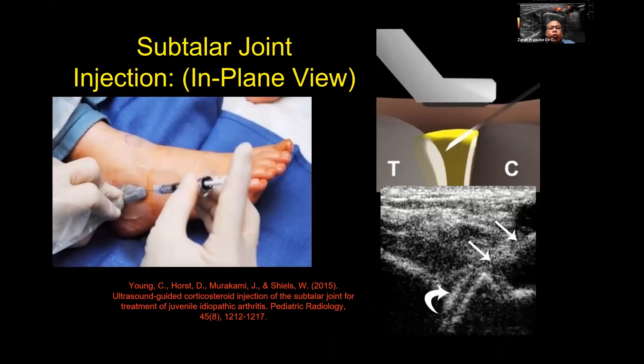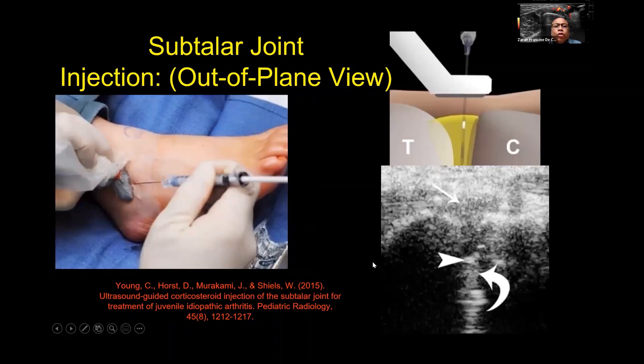This area is also a site for interventional procedures such as subtalar joint injection. This can be done with an in-plane approach from anterior to posterior, where the needle passes along the joint cleft, or with an out-of-plane view where you see the needle as a point. You can observe how medicines are delivered into this space.